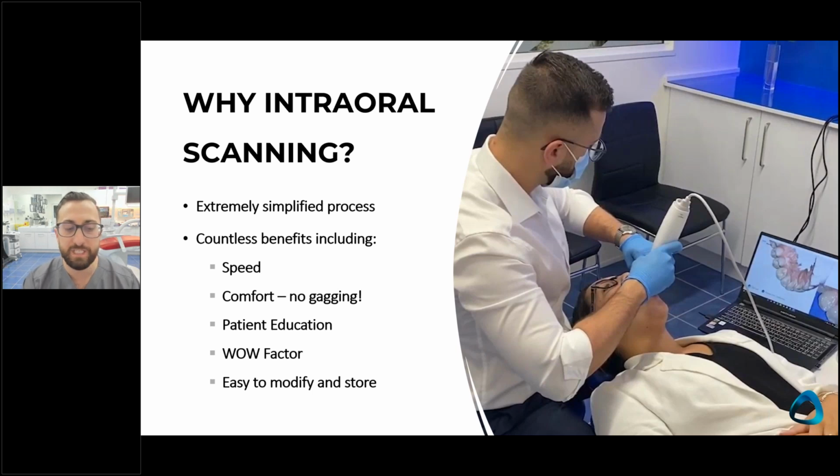One interesting thing to me is when I show my patients scans, one of the most incredible things for them is the color. That's what they comment on most commonly, is that, wow, that thing is in color, and it blows their mind. And also it's easy to modify and store. There's no more stone models everywhere, dealing with impression material which you can't modify. When you take an impression, you just pray that there's no air bubbles, because if there is, you're redoing it. So there's just endless benefits.